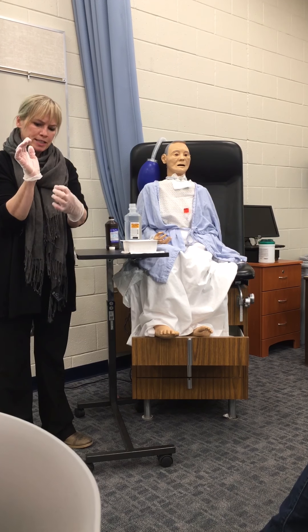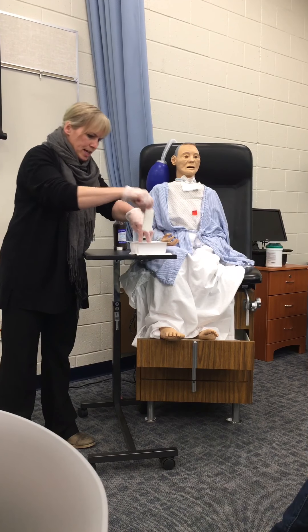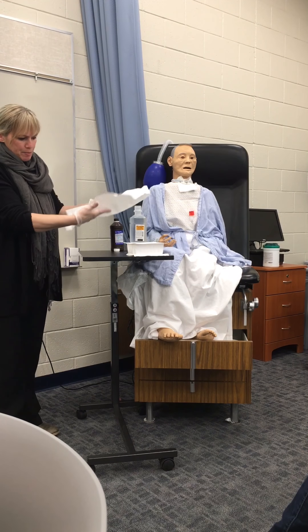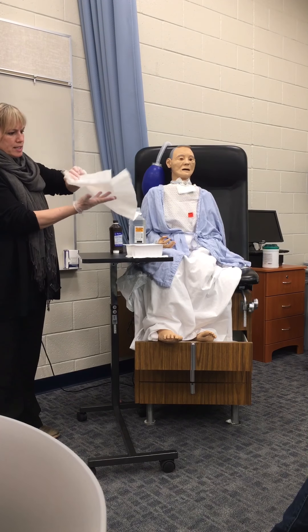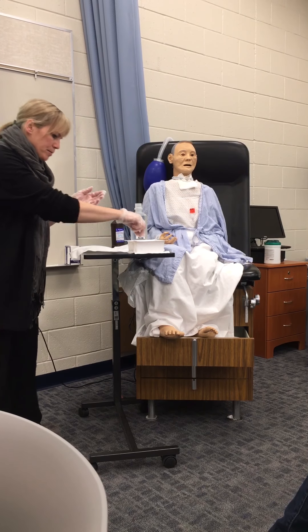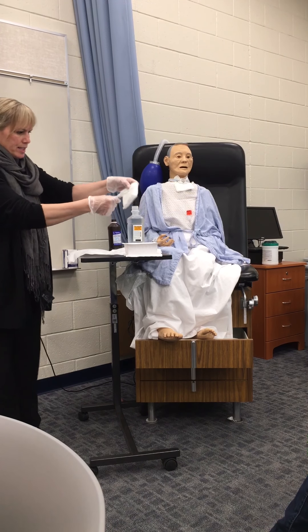It doesn't feel great, but I'm not going to touch that. Now, if I happen to touch the inside, it's okay because I'm sterile. What I have to do is empty all the contents on the sterile field. Simple drape — what I don't want is my hands closest to this; I want my hands above. One side is waterproof, typically one is not. Just let it rest — you can have it wherever. Now, they don't want us to flip anymore, so you just go through and take your stuff.